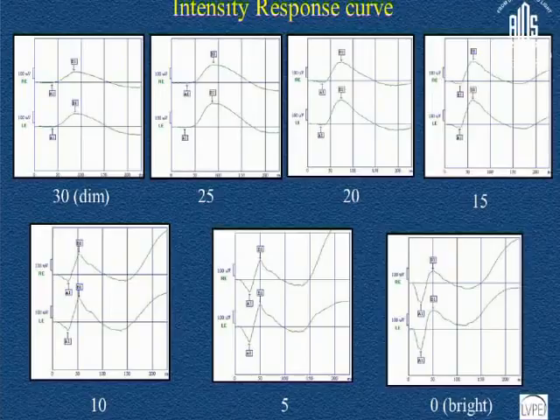So when you look at the scotopic response, don't automatically think that an absent low intensity scotopic response means that the photoreceptor is dead.